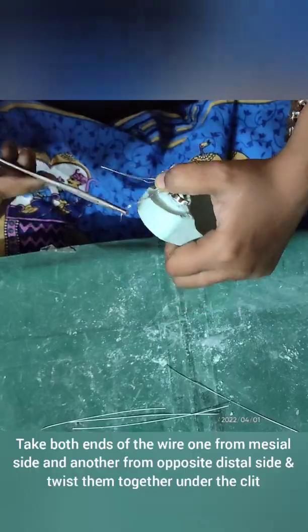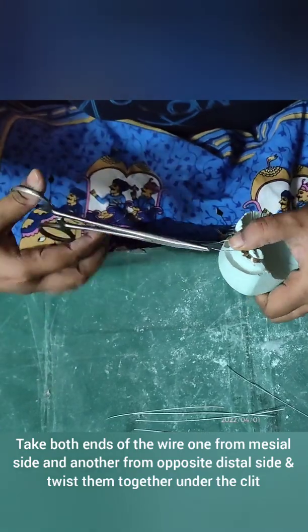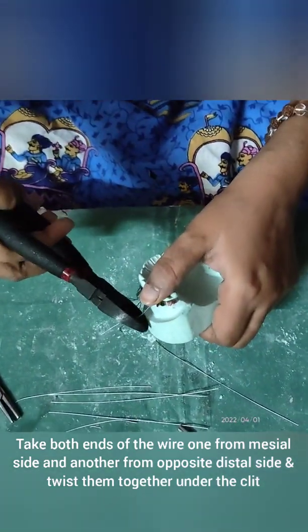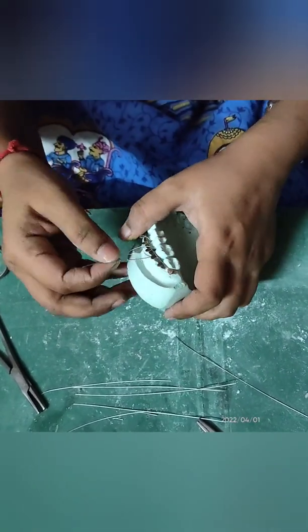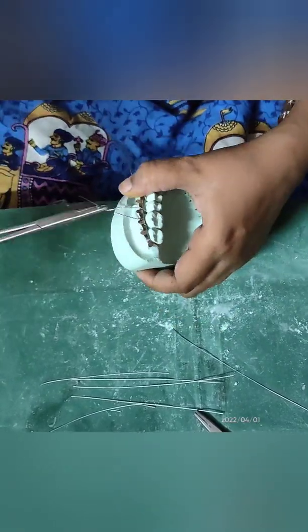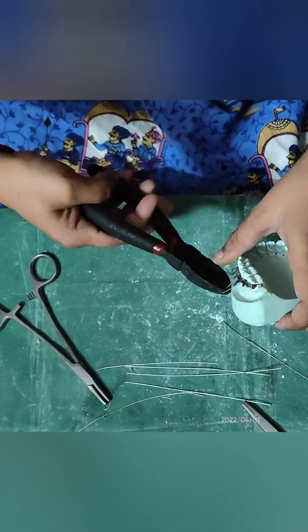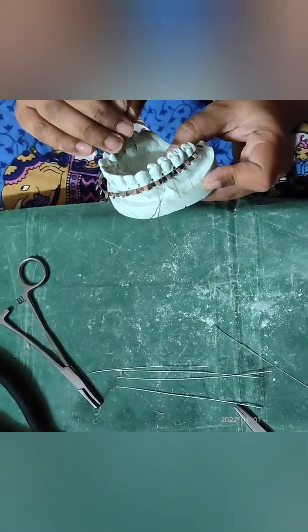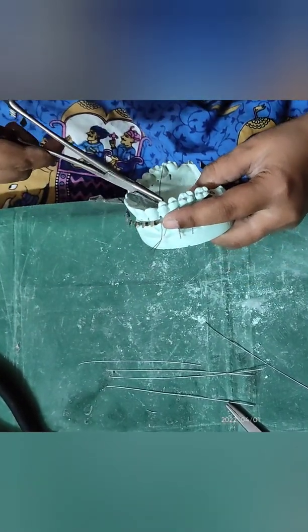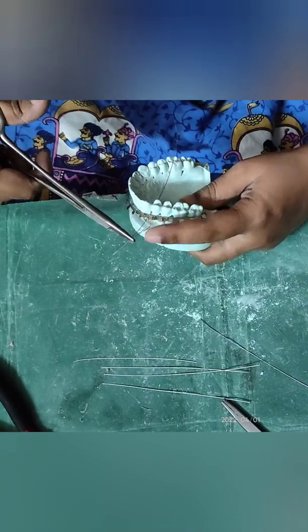Now take the arch bar — both the ends are pulled and twisted. Cut the extra part. The same thing we are going to do with this wire as well. Cut all the way out until complete.